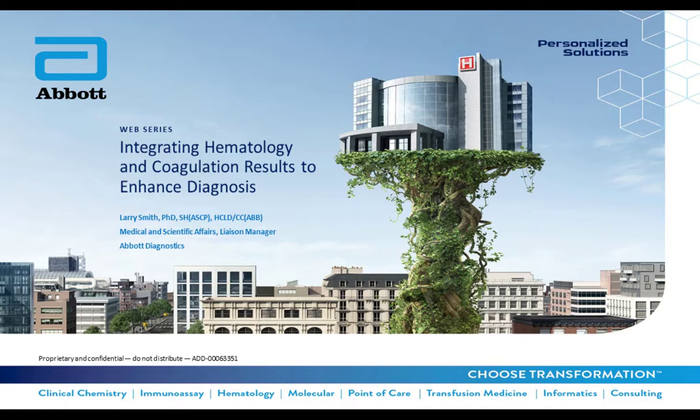Thank you for that question. There are ways that you can improve sharing the results when the two laboratories are not physically located together, but it would probably require some type of middleware such that the people on the hematology side would be able to see the results simultaneously from the coagulation side and vice versa. That would probably be the best way to see the results. Of course, you could see the results in the LIS before you actually accepted and sent the results off, but that would probably slow the process down. So I would think that a middleware solution might be a better fit in that scenario.